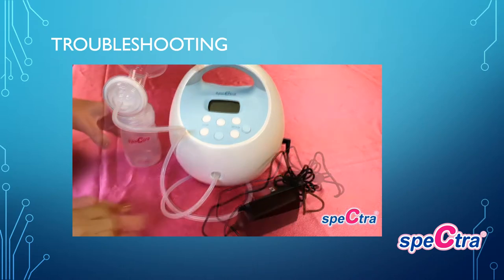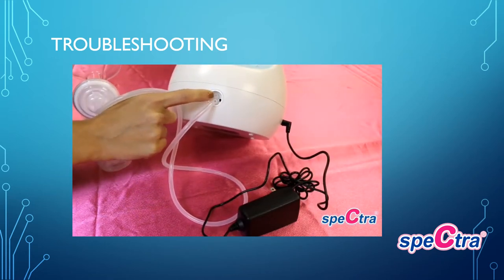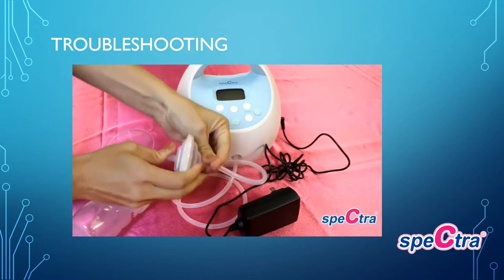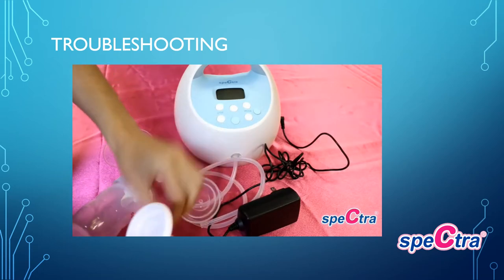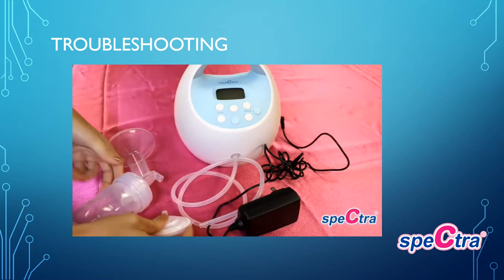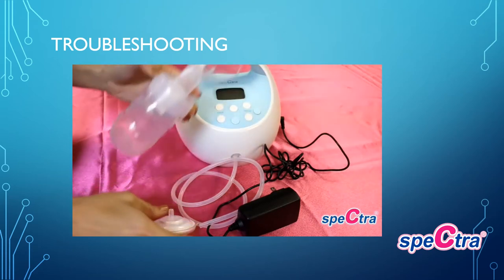If your pump turns on but has no suction, make sure your tubes are completely attached onto the ports. For single pumping, ensure the air cap is completely covering the second hole; for double pumping, both tubes must be securely pressed onto the ports. Make sure your backflow protector is assembled correctly — check that there are no tears in the valve membrane, the valve is pressed over the smaller casing creating a tight seal, and both casings are pressed firmly together. Make sure your valves are properly placed on the bottom of the flange, as this creates the suction.